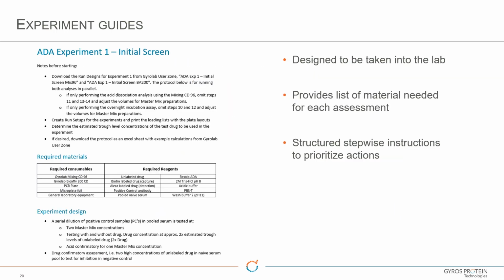So looking at the guide for the experiments that need to be run, this guide is designed to be taken into the lab. It provides a list of materials needed for each assessment and gives us structured, stepwise instructions to prioritize actions.